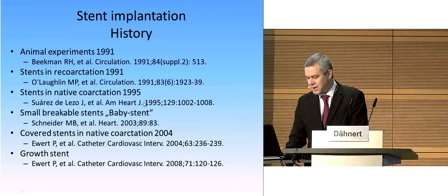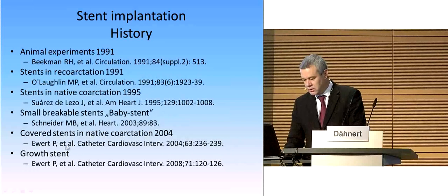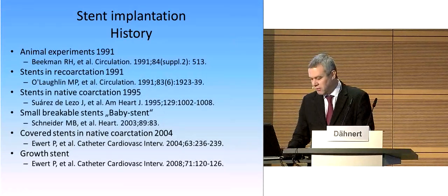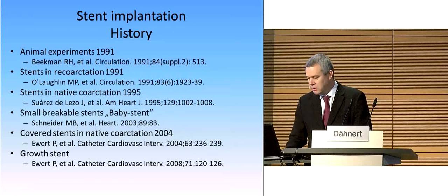Martin called his stents baby stents, Peter called his stents growth stents, but these stents are not commonly available for everybody yet, but they are under development.